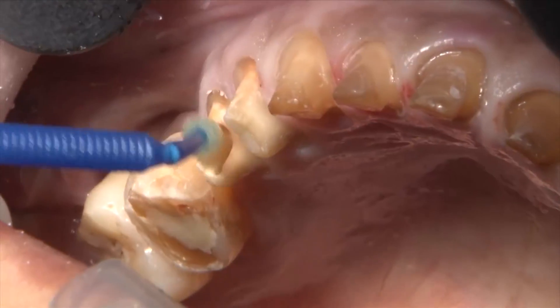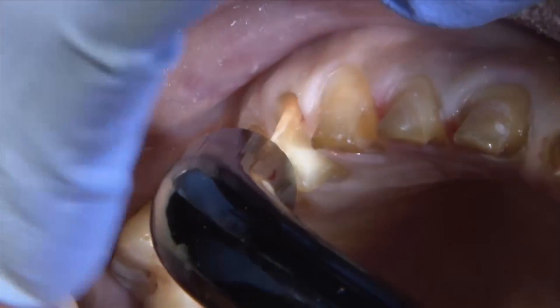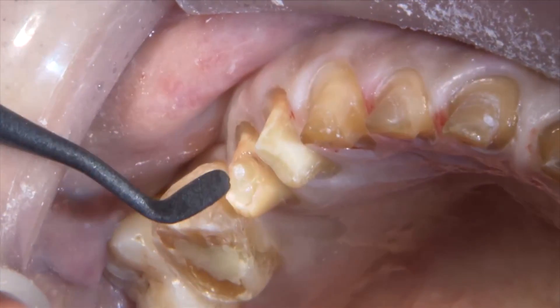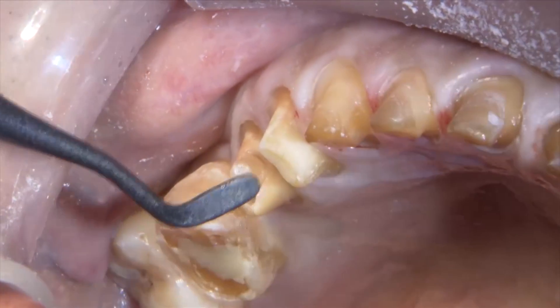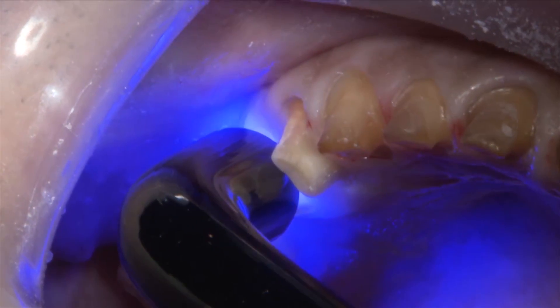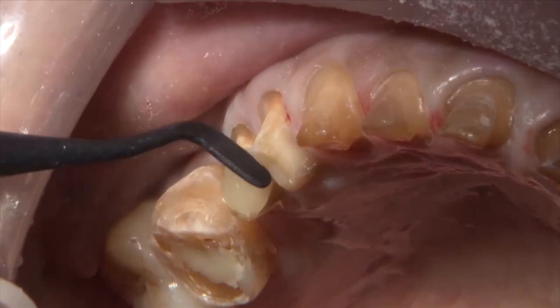Now anytime we're getting ready to dismiss the patient, whether we're putting on a temporary crown or a permanent crown, we're going to put on those two one-minute coats of Gluma — or any of the Gluma-like materials. In this case it was the G4 from Clinician's Choice, or it could have been Micro Prime from Danville Engineering — there are all kinds of those that are exactly the same. We lost a little build-up here so I'm just using some composite to build this back up again.